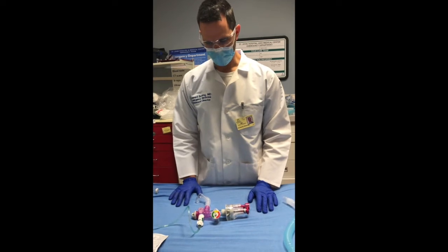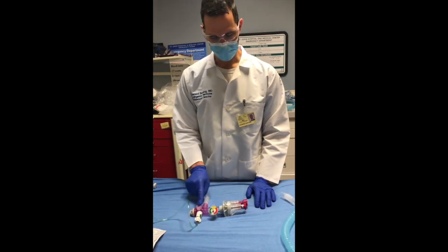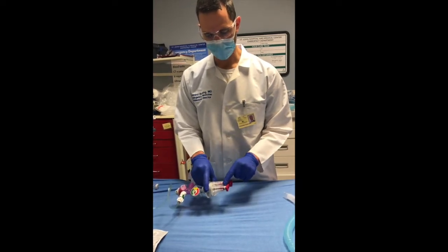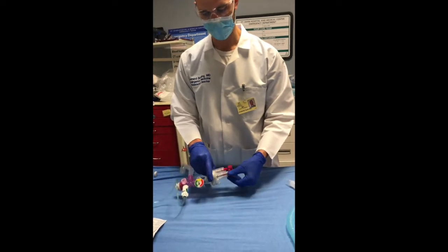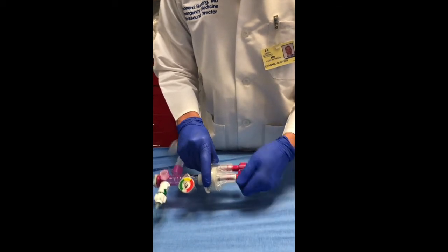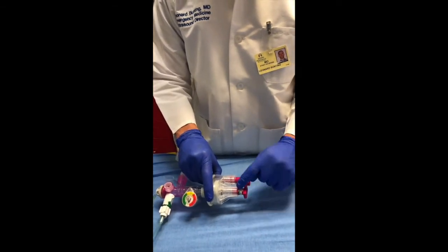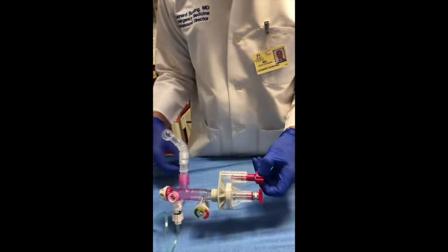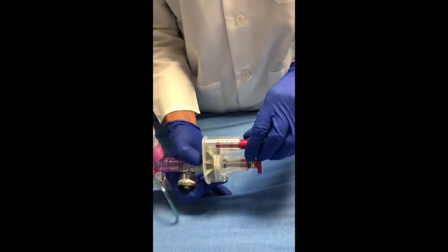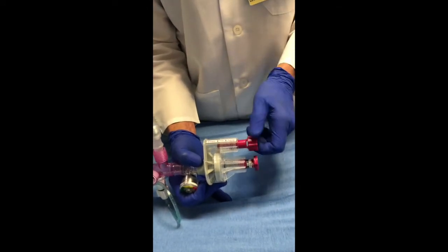The other things on the Vortran are the pressure meter, which tells you how much pressure is actually being delivered to the patient, a pressure relief valve, and this T-nut or T-screw. The T-screw sets how much pressure is being delivered to the patient — as you tighten it, you're increasing the pressure, as indicated by the stripes on the sticker, and as you loosen it, you're delivering less pressure. The other screw sets the rate: as you screw in you slow the rate, and as you unscrew you increase the rate.